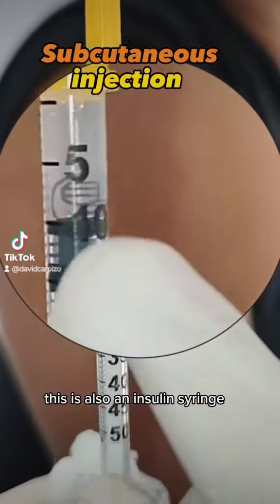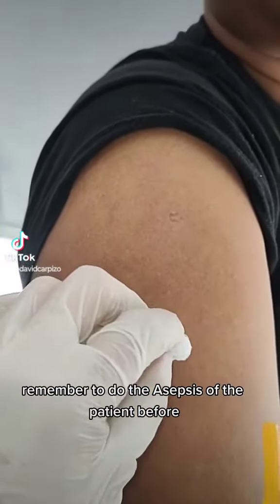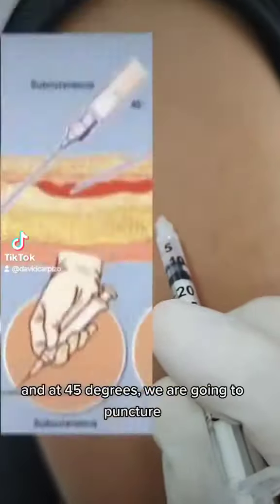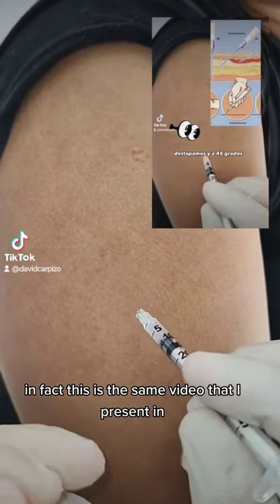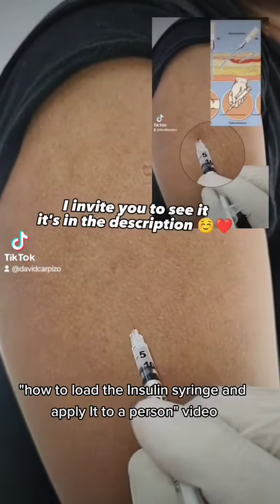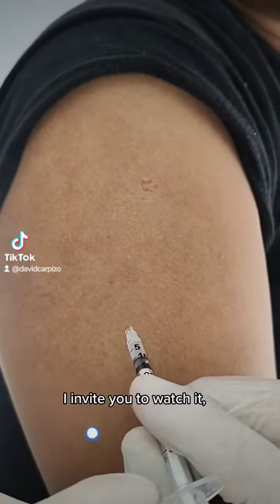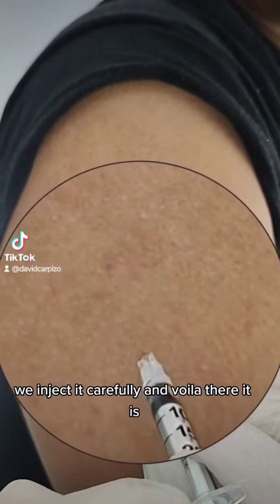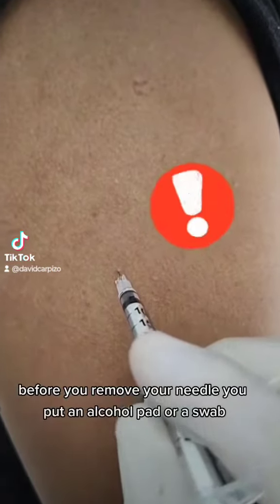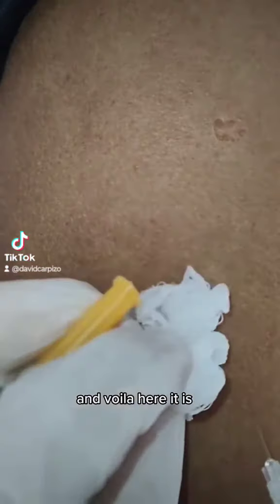This is also an insulin syringe; I am going to inject 10 international units. Remember to do the asepsis of the patient first, from the center to the periphery. We uncover and at 45 degrees we are going to puncture — this is the same video I present in the 'how to load the insulin syringe and apply it to a person' video, I invite you to watch it. We inject it, and before you remove your needle, put an alcohol pad or a swab on the site. Voilà, here it is.